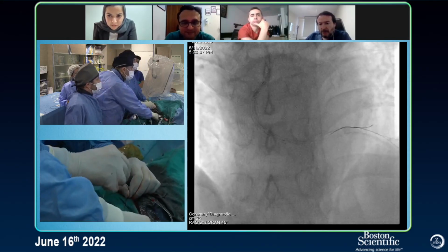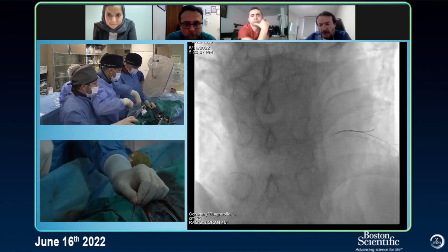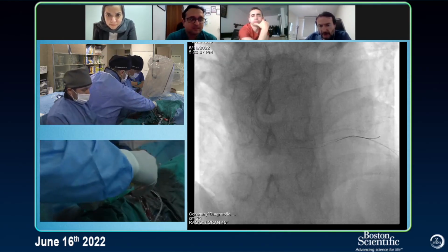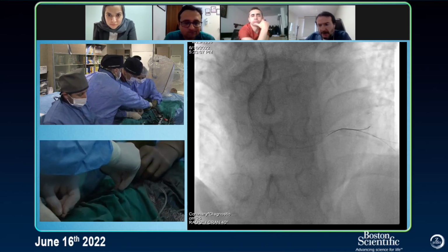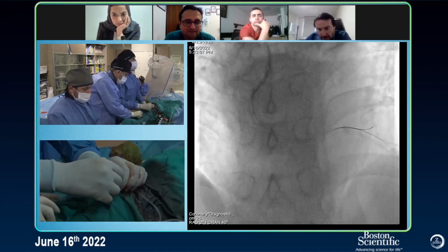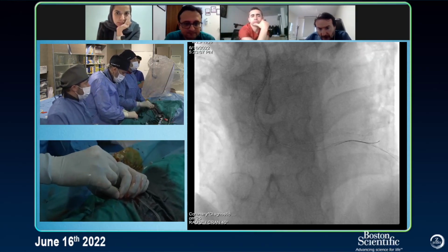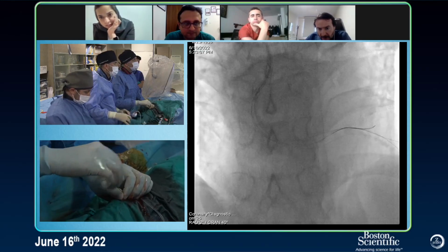If you can do that, maybe you have to pin your balloon to the stent and then remove the whole system. That would be safe, I think. It's a bad option, but it's the safe one. Let's see. I'm happy if I remove this stent, which I don't know.